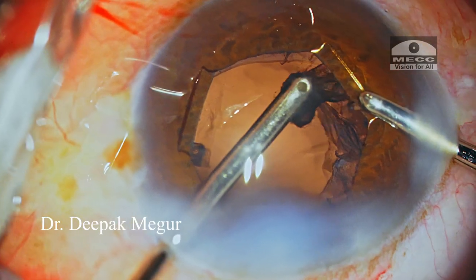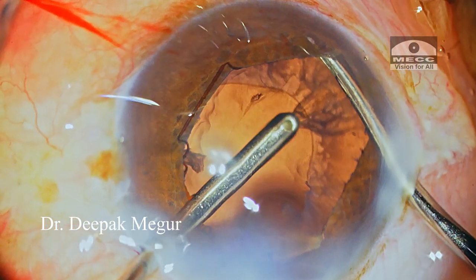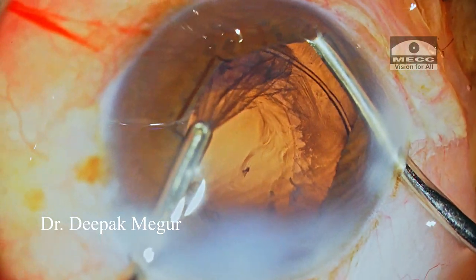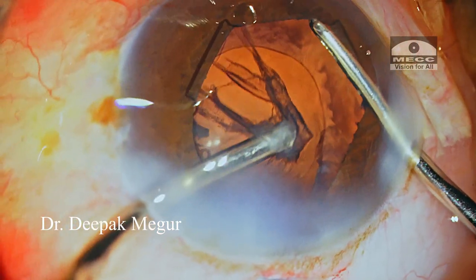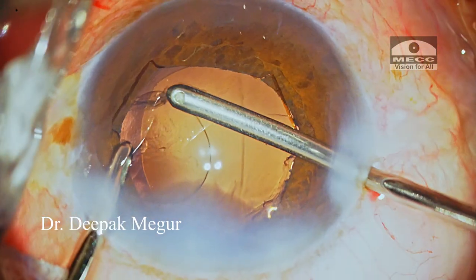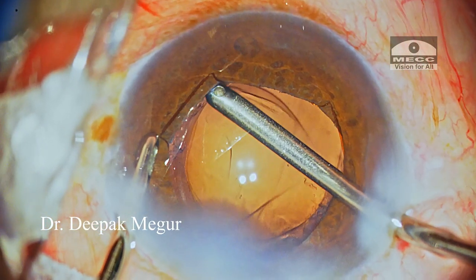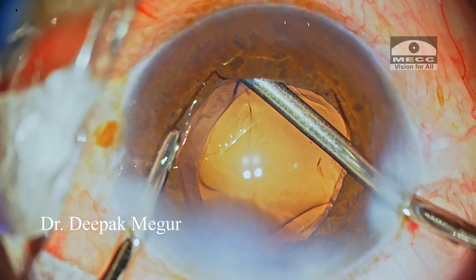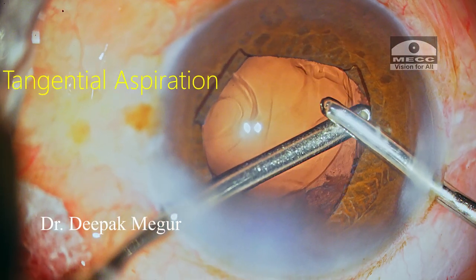Being patient and careful and cautious — this approach is going to be very helpful in such situations. I retract the iris so I can see well what I'm aspirating, and then slowly but surely I strip the cortex in a tangential manner right under the CTR. Similarly, cortex all around is gently aspirated out using tangential maneuvers.